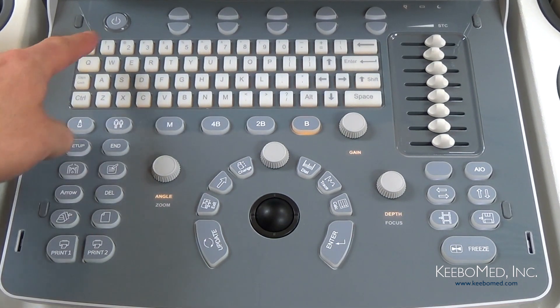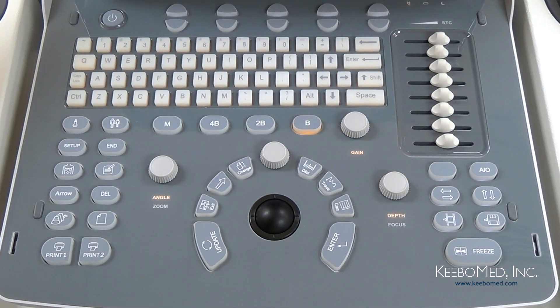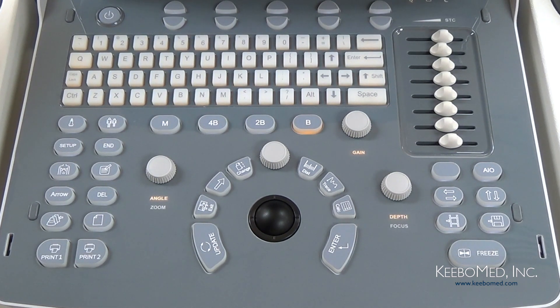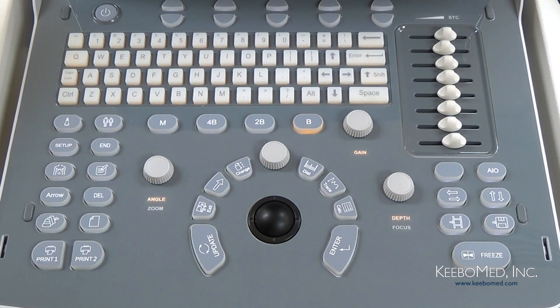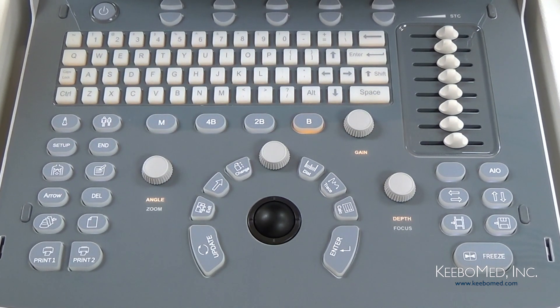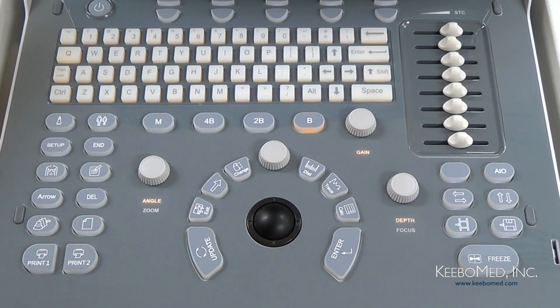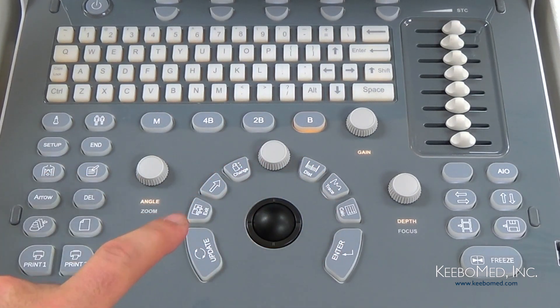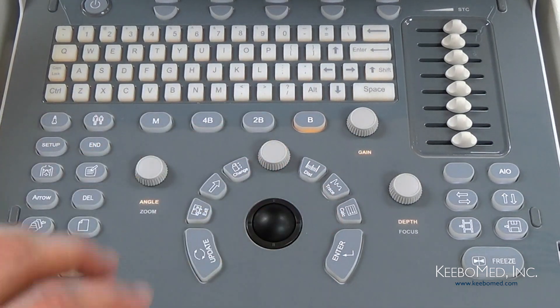In the upper left corner is the power button — just press it for a few seconds and the ultrasound will power up. One of the first things you may notice is how the keyboard layout is really simple and designed for use with one hand. It is really easy to navigate using the trackball, which is about centered on the keyboard, and the keys that surround it are placed so they can be easily accessed quickly while scanning patients.